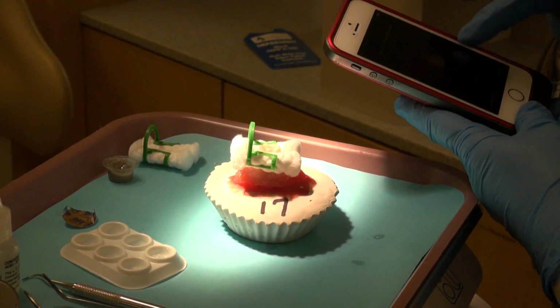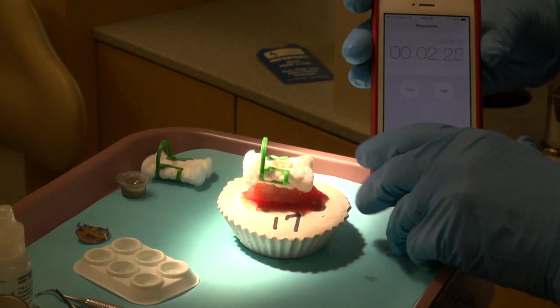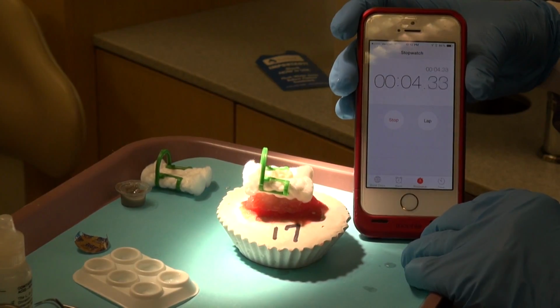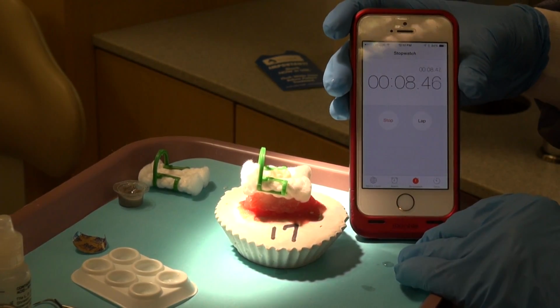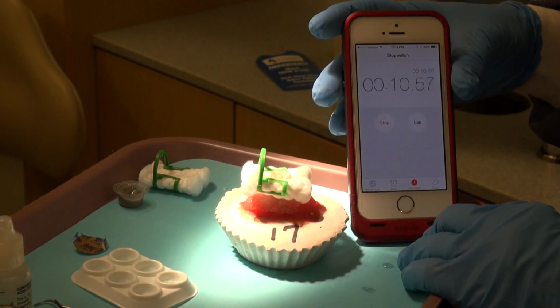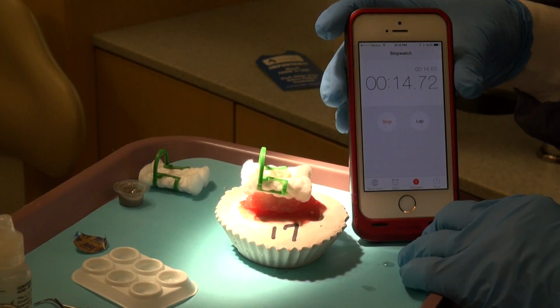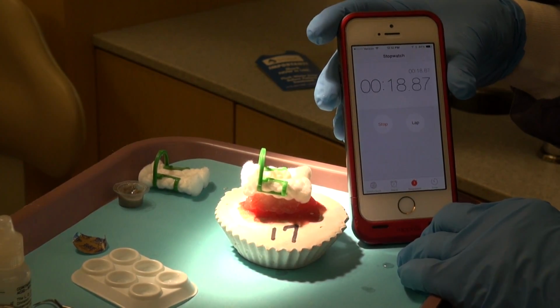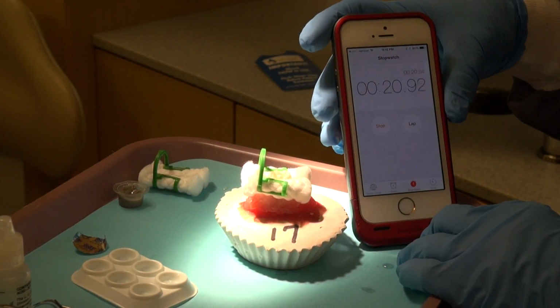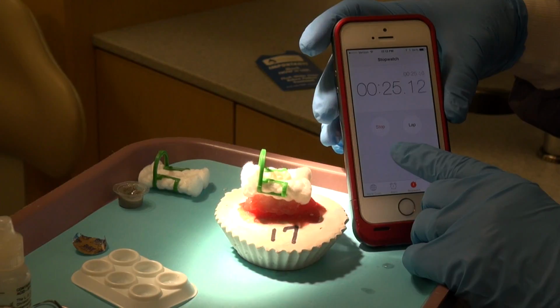We're going to set our timer for 30 seconds. This is how long the acid etch will sit on the teeth. And in 30 seconds, we're going to rinse it off. You want to make sure you either have a second hand on your watch nearby or a timer, or yes, you could use your cell phone, but you need to have that present. And we're going to stop this at 30 seconds.